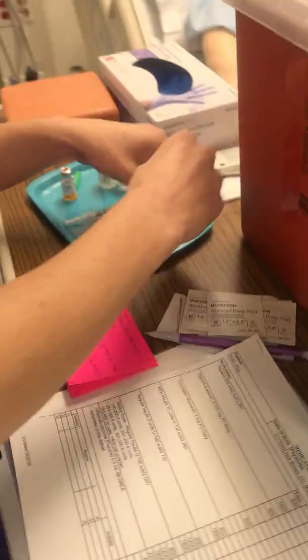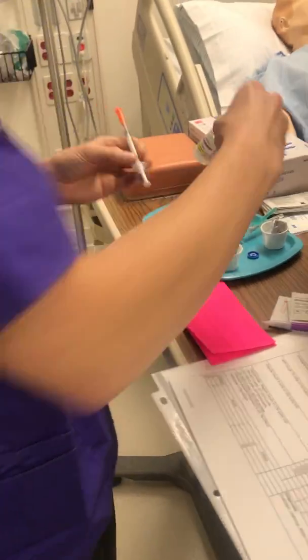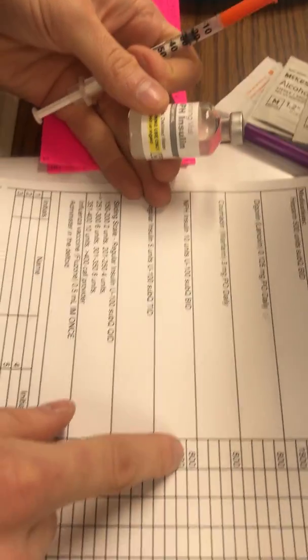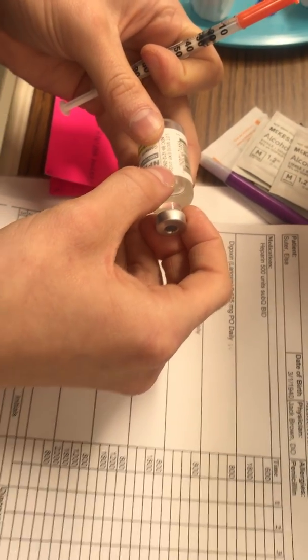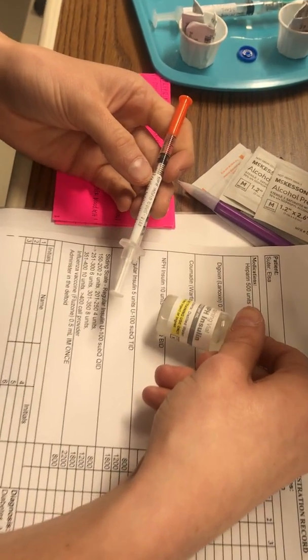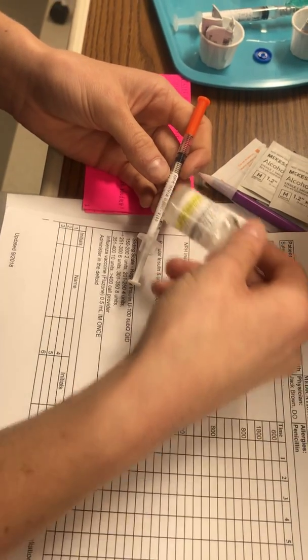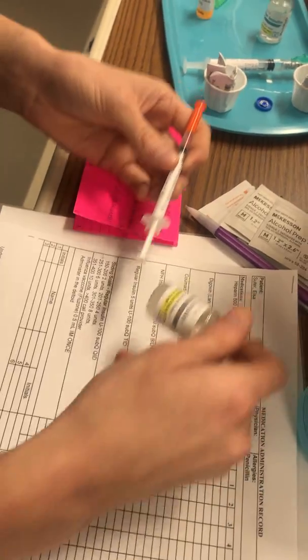So, like I said, doing my third safety check. And so next I'm going to be doing my insulin. So I'm going to compare this here, NPH insulin, 10 units, U100, sub-Q, BID, 8 a.m., no allergies, right patient. NPH insulin, U100, yep, this is correct, not expired. And then this all matches my chart, and another nurse watched me draw it up. Now she's watching me administer NPH insulin, 10 units, U100. It all matches here. No allergies, right patient.